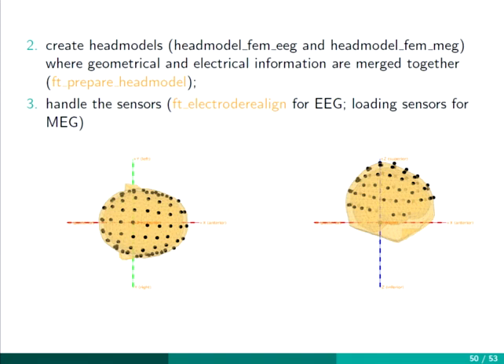You just use the general electrode configuration for, say, an EEG layout. Can you feed something like that into this with your individual subject MRI? Also, like the templates are available, even though the cap may not have been exactly in that space for that individual subject.